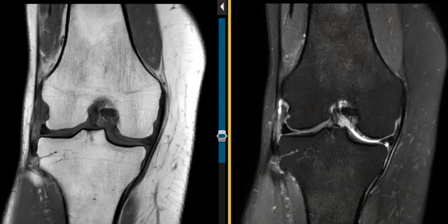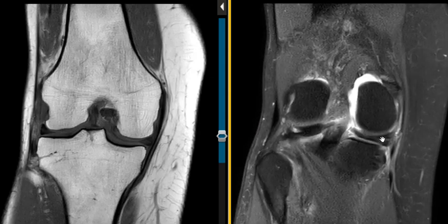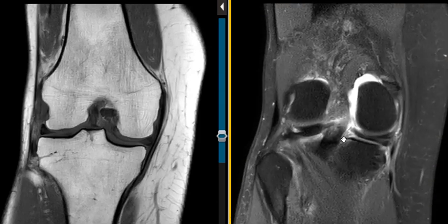The medial meniscus looks pretty good here in the meniscus body, but as we go towards the back, we see the meniscus coming across, and the end of it is right here. Right here is fluid from the knee going into the tear. This is called the meniscus root — the back here is called the root — and then the posterior horn is here. So this is involving the posterior horn root junction, the meniscus root.